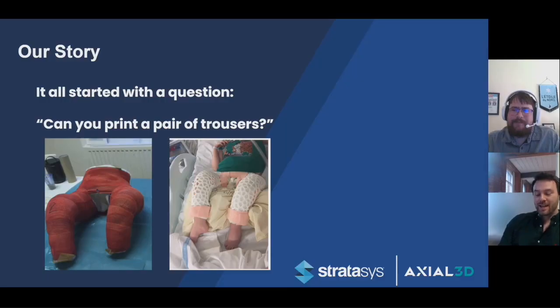And he was looking at this child's femur in a coffee shop, a child who had a condition called osteogenesis imperfecta, some really brittle bones, and was measuring up different devices and making plans in the coffee shop. That's another one of the huge benefits of getting medical models: it unlocks a different way of thinking and allows you to step outside the clinical environment to do that thinking as well.